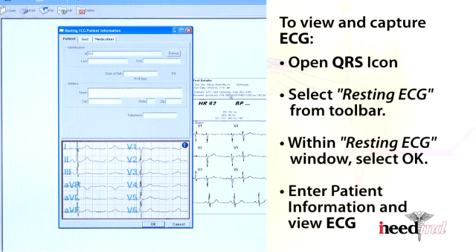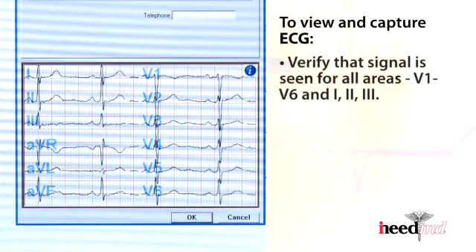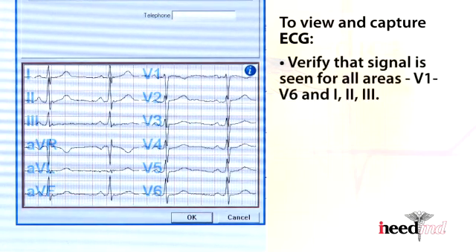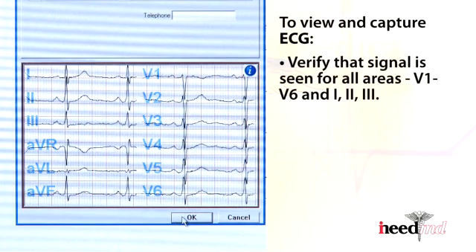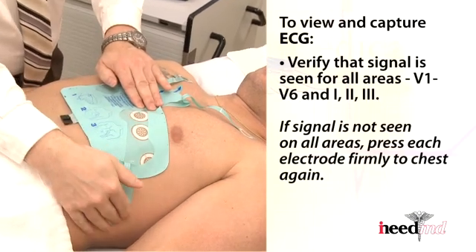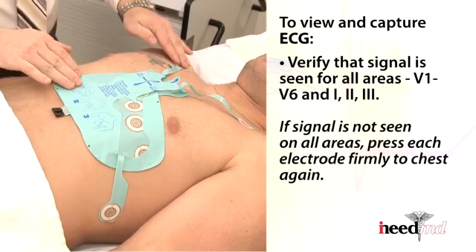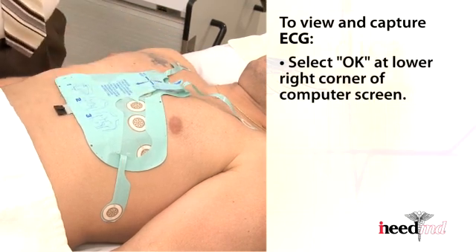Enter the patient's information and view the ECG. Verify that the signal is seen for all areas — V1 through V6 and leads 1, 2, and 3. If signal is not seen in all areas, press each electrode firmly to the chest again. Once signal is seen on all areas, select OK at the lower right-hand corner of the computer screen.